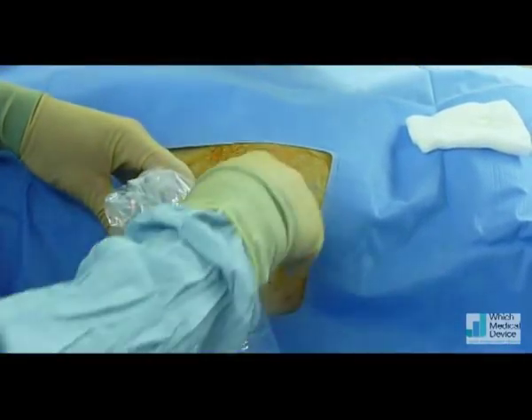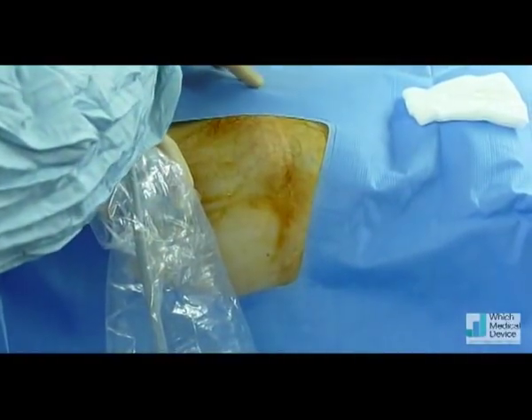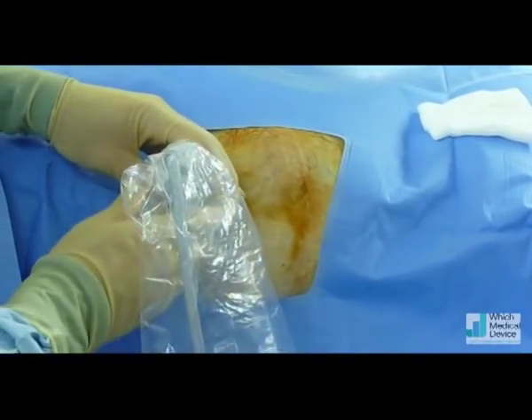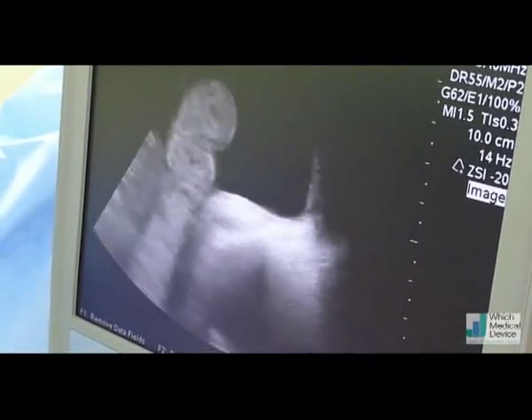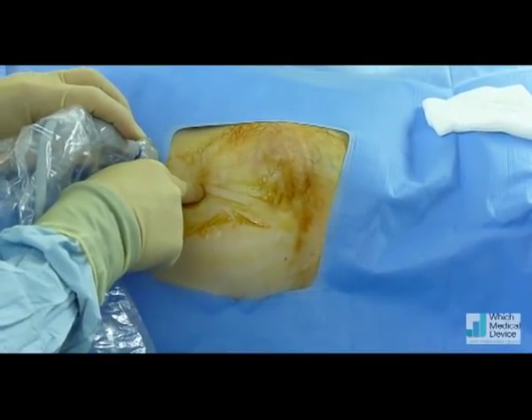This gentleman's got quite a lot of ascites. He's got a hernia here which we're trying to avoid to a large extent, but because he's had a previous PleurX drain here that's just stopped working, we're going to have to work our way round towards where the hernia is. If you look on the screen you can see the volume of ascites going more inferiorly down towards the pelvis. So more inferiorly is where we're going to make the peritoneal puncture — about here — and the catheter will be tunneled superiorly to come out through the skin here.